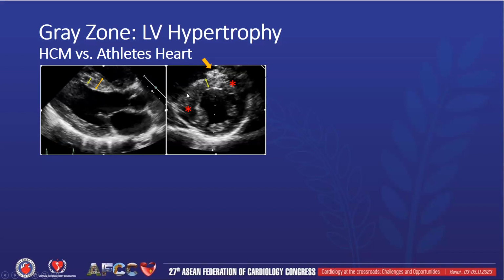interventricularis here. But when you're doing all of this, you don't want to lose sight of the fact that the inferior septum can be the area of hypertrophy, or the anterior wall can be the area of hypertrophy. Those areas are a little bit silent on echocardiography, so we have to pay attention to them. We don't see those very well except in the short axis view, and sometimes when image quality is suboptimal, there are areas that drop out in these regions.